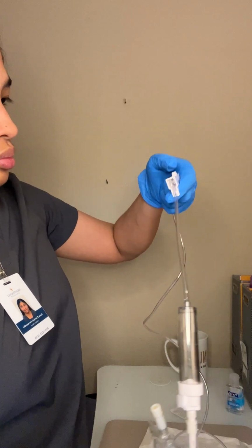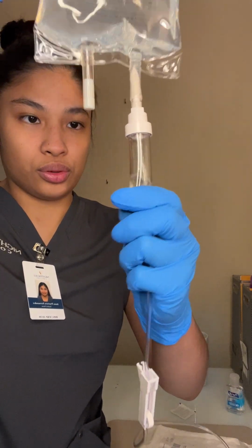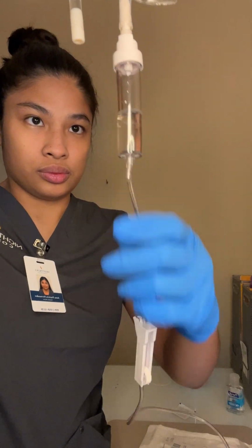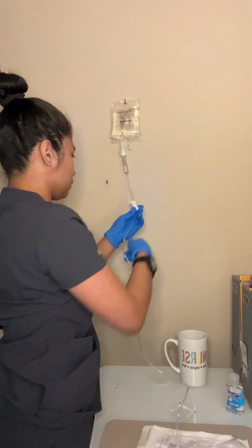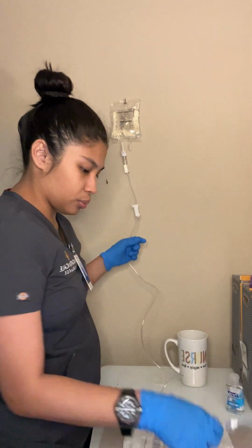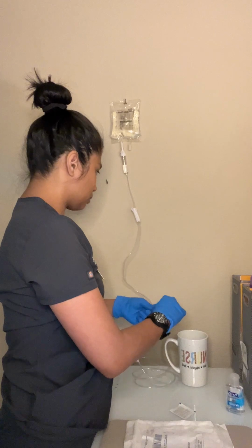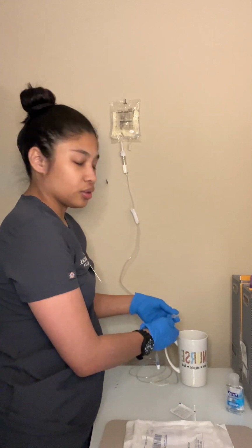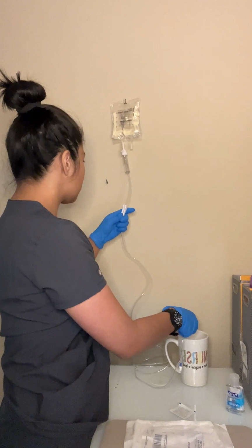So you want to fill this halfway full, and then hang it. Next, you'll prime the tubing. You'll slowly prime the tubing, making sure that there are no air bubbles.